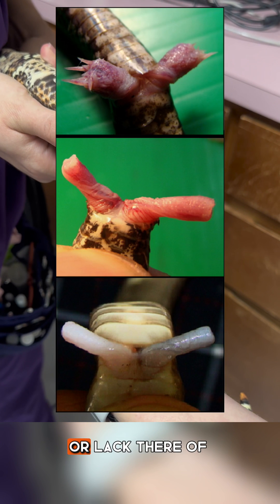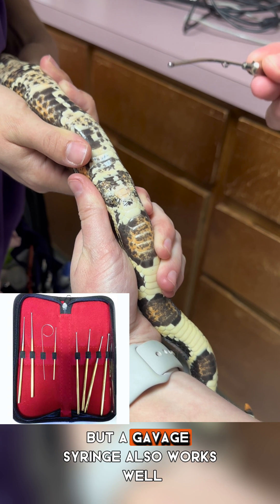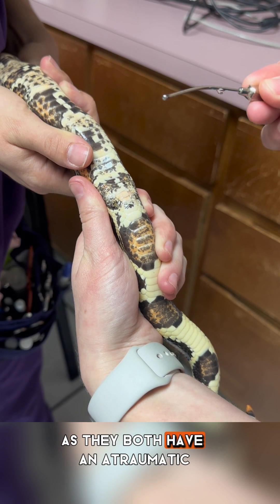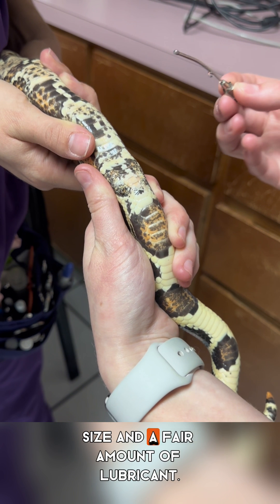We're feeling their hemipenes, or lack thereof, if they're a female. They sell special snake probes online, but a gavage syringe also works well as they both have an atraumatic rounded end. Just make sure you use the appropriate size and a fair amount of lubricant.